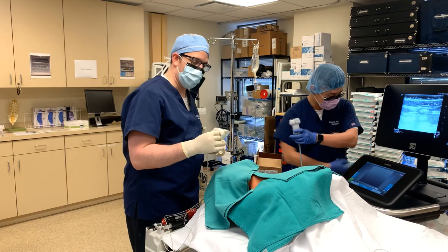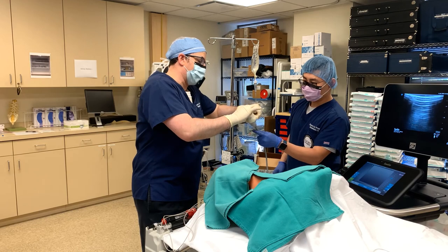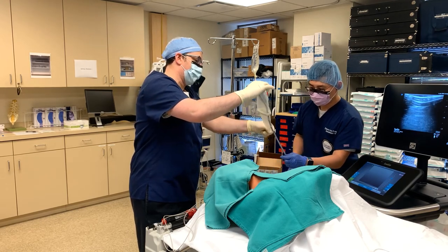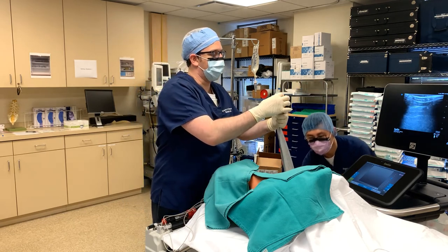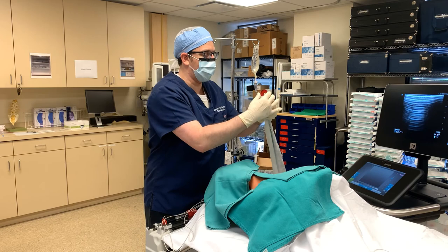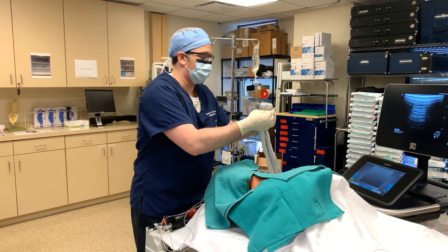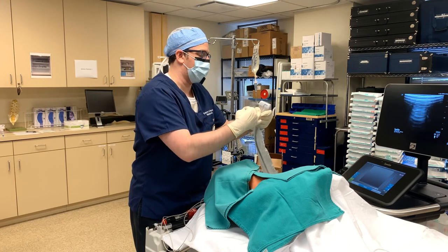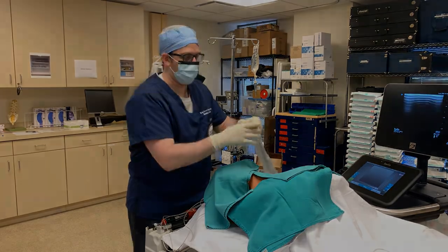This is the part where hopefully we don't struggle too much. I'm making sure at all times not to touch any part that's not sterile, and my assistant can grab the end. I'm going to go ahead and pull the cover nice and tight so that there's no air in between the cover and the probe itself. I'm going to flip this rubber band back twice, and that looks great.